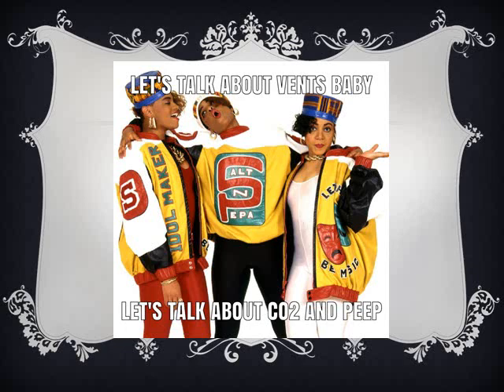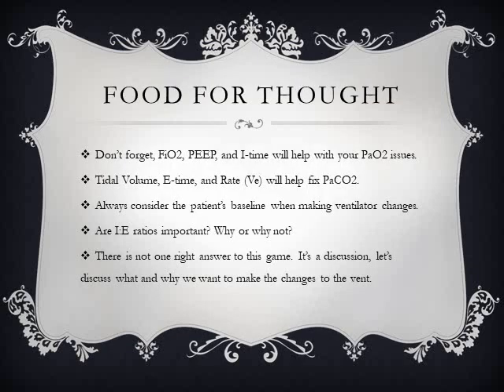And memes are always the best thing to do to get your point across. Alright, so just food for thought as a reminder: FiO2, PEEP, and I time are usually what you go to for your PaO2 issues. Tidal volume, expiratory time, rate, which is minute ventilation, will help fix your CO2.